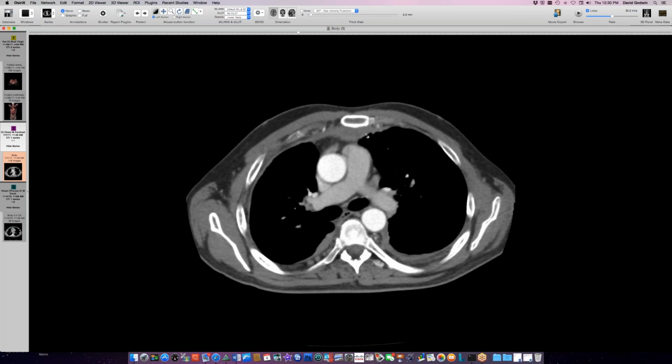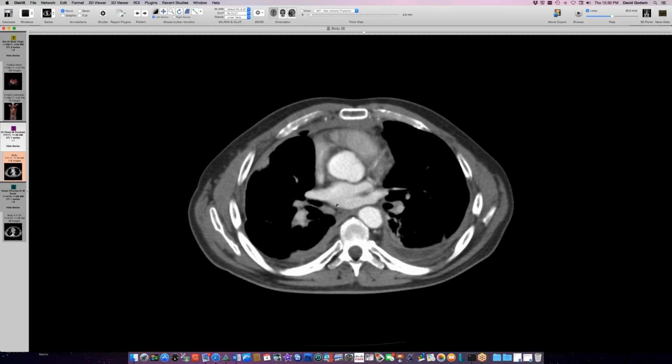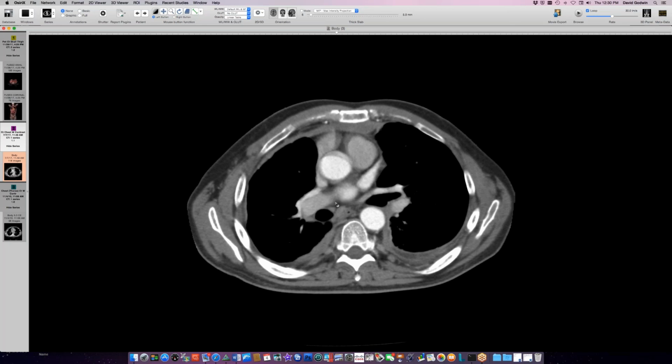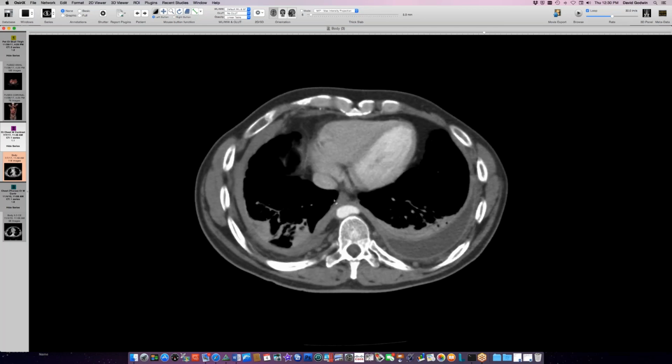So the person had a biopsy of this anterior mediastinal fibrous tissue, and they got back fibrous tissue with a lot of plasma cells in it. Furthermore, a lymph node was biopsied at the same time, something like this perhaps, but maybe not that one specifically. And that also showed an infiltration with plasma cells. And on plasma cell staining, they got up to 20% IgG4 positive plasma cells on staining. And so at this point, this is presumed IgG4 disease.